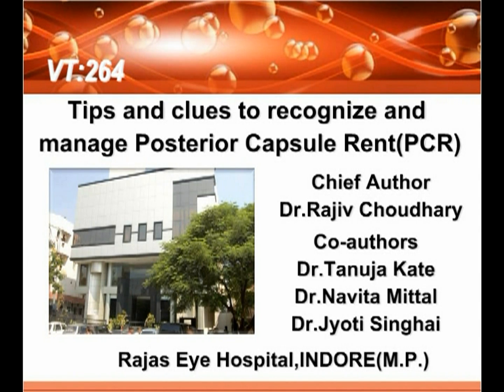This video compilation shows how to recognize posterior capsule rent (PCR) so that timely intervention results in a better outcome. Also shown would be the management modalities once the posterior capsule rent has occurred.